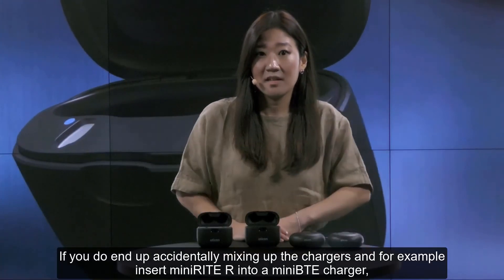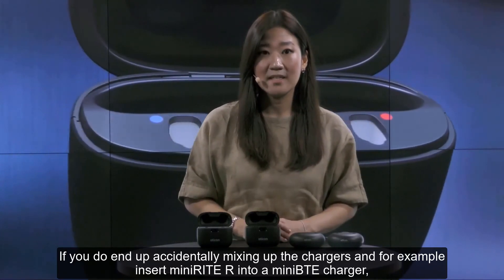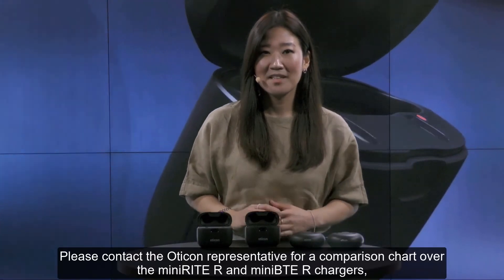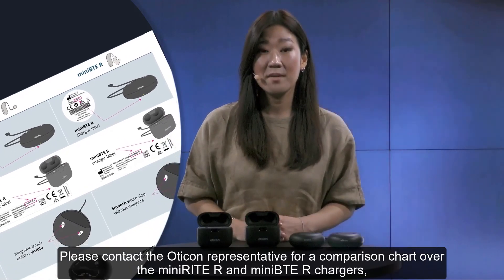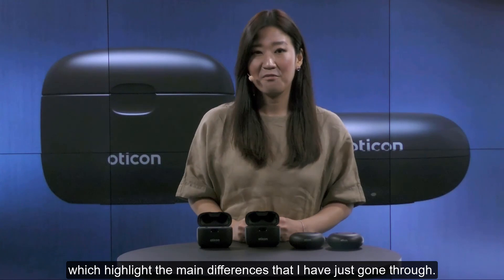If you do accidentally mix up the chargers and, for example, insert a Mini-BTE R hearing aid into a Minirite R charger, it won't break the hearing aids. Please contact your Oticon representative for a comparison chart covering the Minirite R and Mini-BTE R chargers which highlights the main differences just discussed.